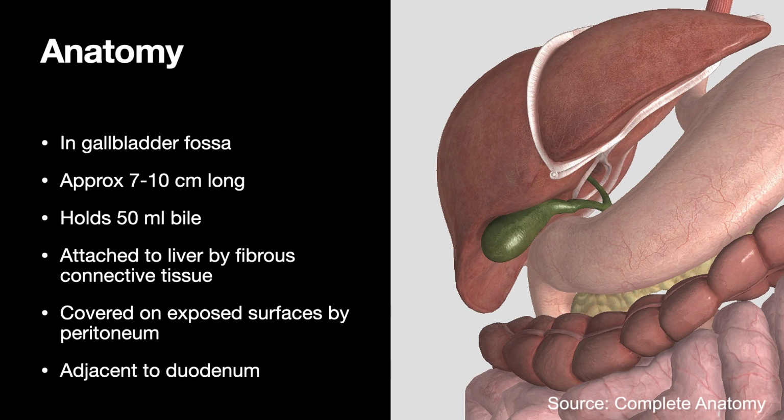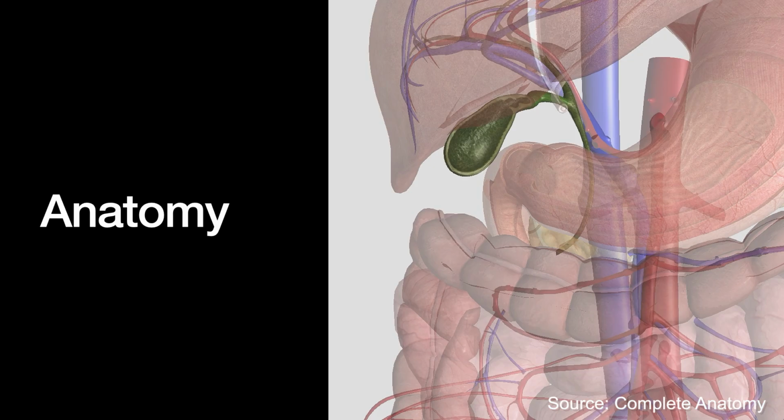Okay, adjacent to the duodenum as things pass through. From an anatomy standpoint, here's a little bit of an image just to show that it's this hollow viscus thing. There you see that corrugated stuff at the end. These are called the spiral valves of Heister. You can sometimes see these on the gallbladder as we scan through them, right?